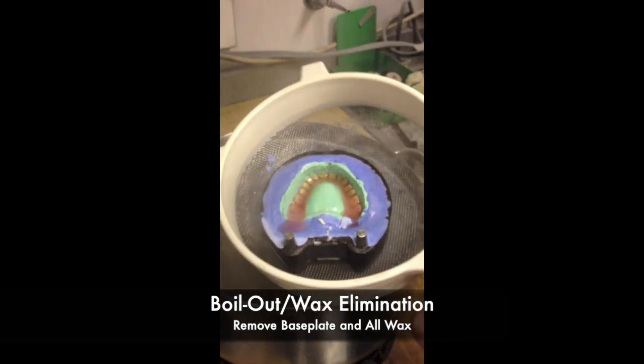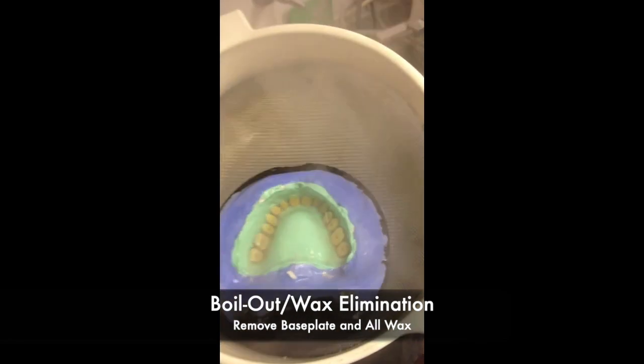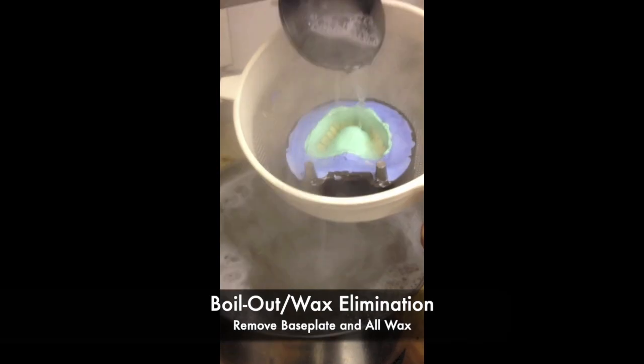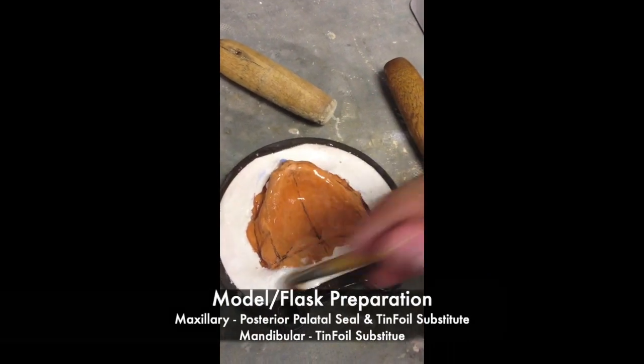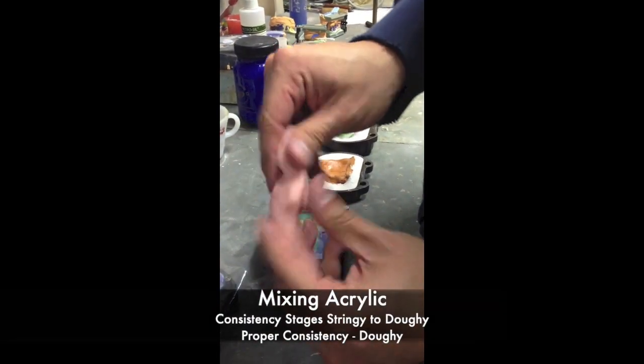You will put these back into the boil out unit and make sure all the wax has been eliminated. Once the boil out and wax elimination procedures are completed, we can now move to model and flask preparation for packing. Remember, on a maxillary you must carve a posterior palatal seal, and any gypsum surface in the flasks must be coated in tinfoil substitute.